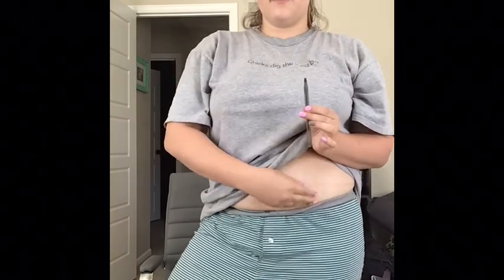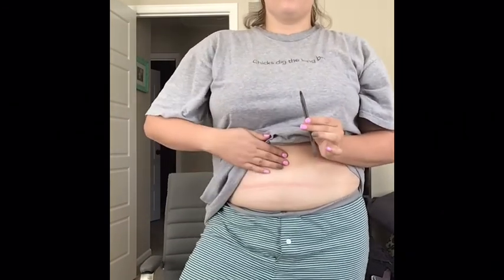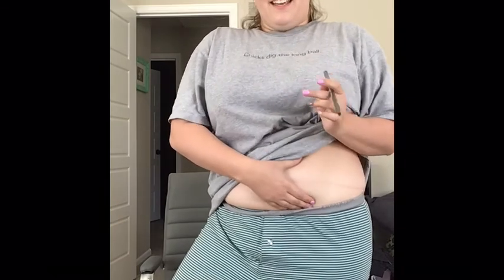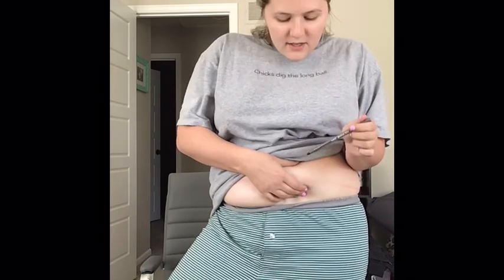So I alcoholed, I'm going to use my non-dominant hand, and I'm going to squeeze. Also, I want to make sure that I'm going at least an inch away from the belly button. So I'm going to squeeze with my non-dominant hand, and then I'm going to inject either 45 or 90 degrees, depending on how much sub-Q fat that person has. So I'm going to release with this hand, let's say this is my plunger, and slowly inject that med in.